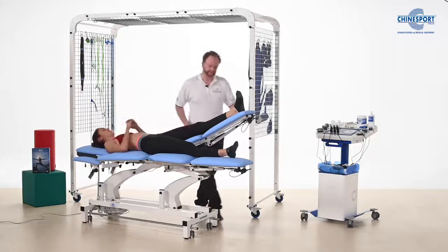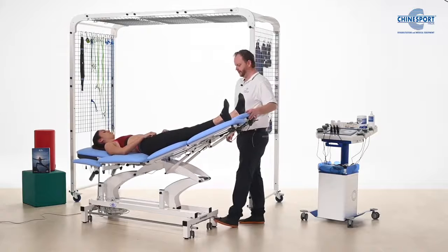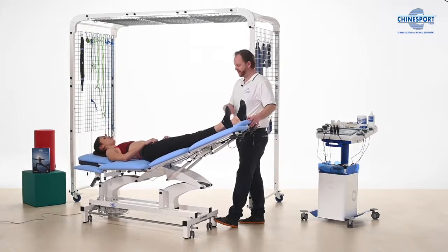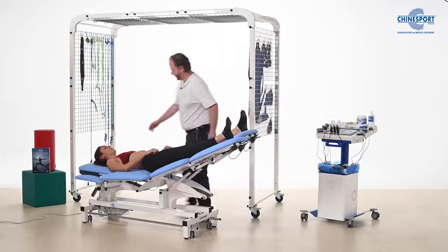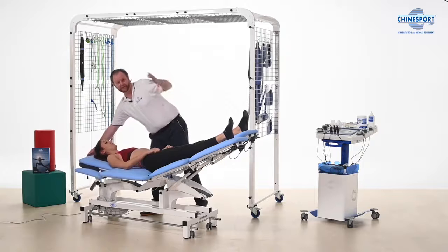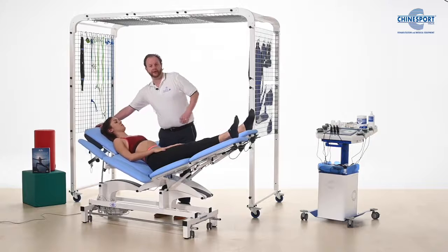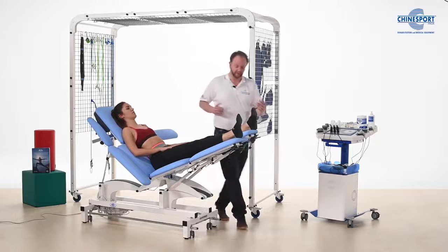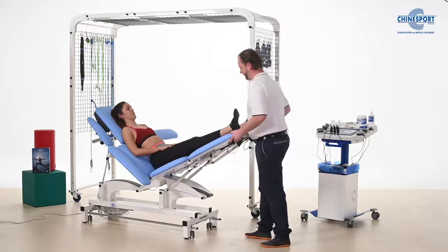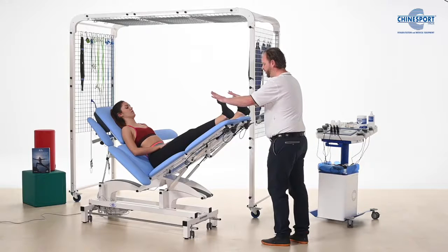If we go from here into a hamstring stretch, people often have problems with hamstring stretches. They're straining against the stretch, and the beautiful thing about this use of the table is that we're letting gravity do all the work. And when gravity does all the work, then the patients are very relaxed, and the patients can feel more what's going on, and they can relax more and go into the stretch and really work into it.